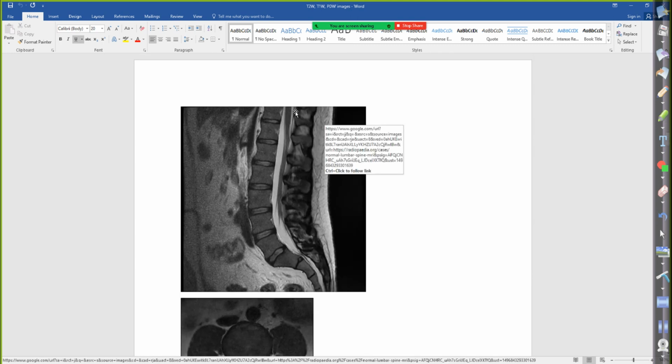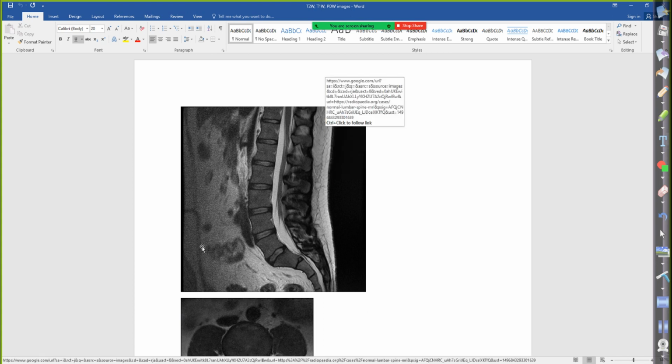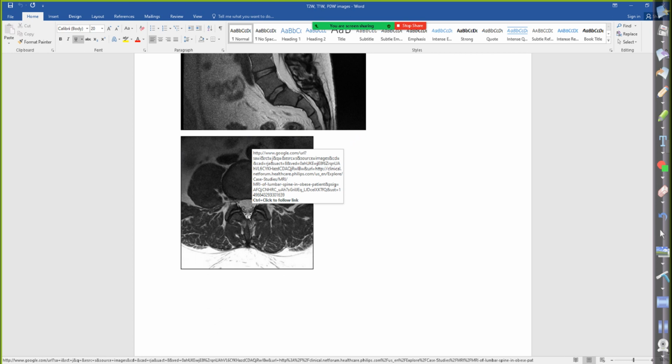Moving down to the L-spine, we know our spinal cord terminates at the conus medullaris, but you can get into the cauda equina, and that's a darker structure than the CSF that surrounds it. All this is fat in the abdomen. All this is subcutaneous fat. Here's our axial. Once again, CSF. We've got all the nerve roots and fibers of the spinal cord.